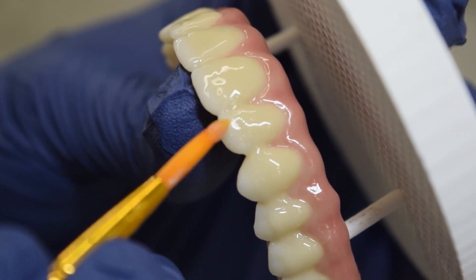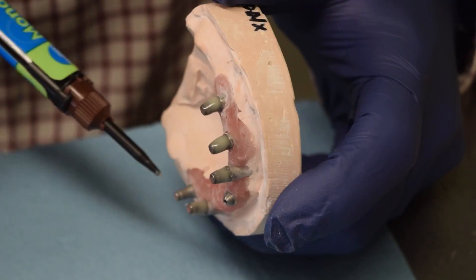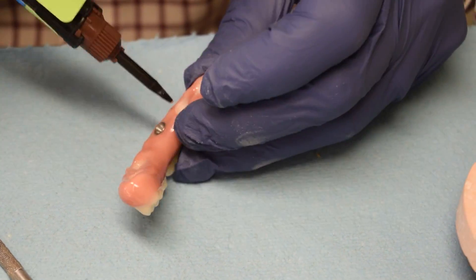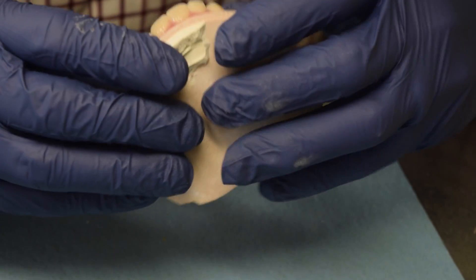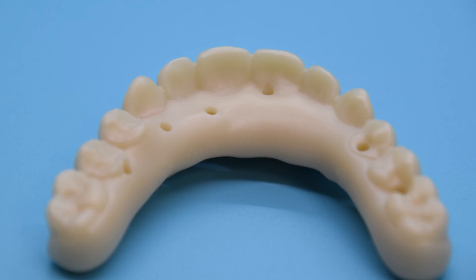The final piece of the puzzle is to cement implant housing units into the zirconia arch. These housing units give the implant screws something to hold on to. Now that the housing units have been added and the all-on-four arch has been properly stained, the restoration is ready to be delivered to the dentist.